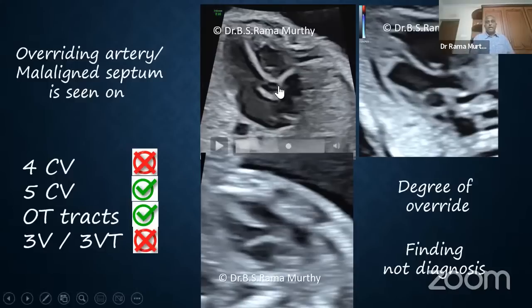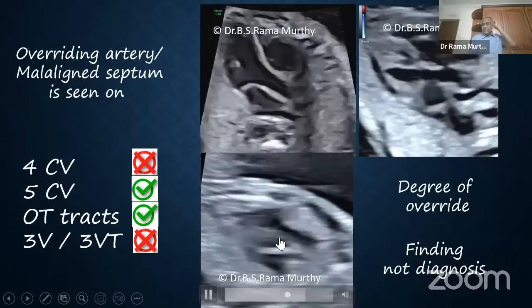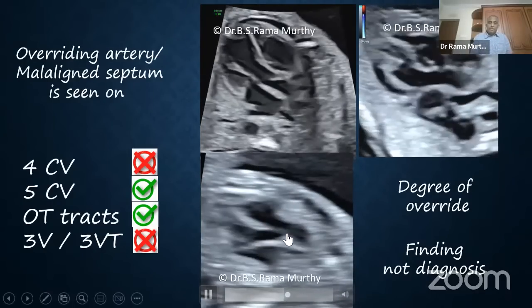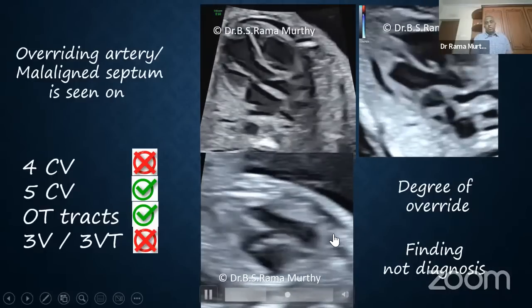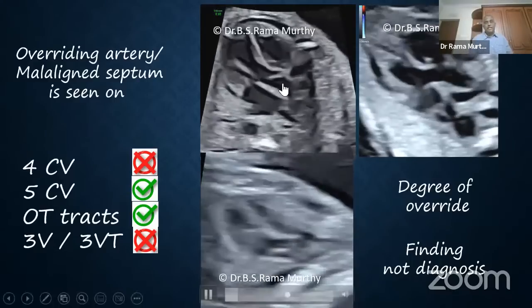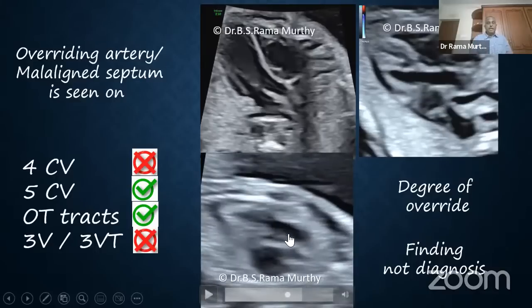So therefore, that's normal. That's a perimembranous VSD, and this is a malaligned VSD, which is always associated with overriding. So you can talk of it in the same breath. Malalignment VSD and overriding are nothing but the same entity. Remember, this is a finding. This is not the final diagnosis.